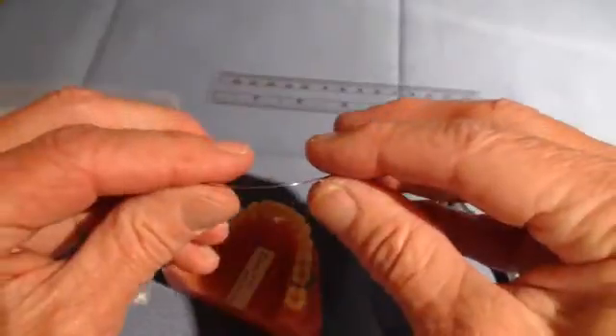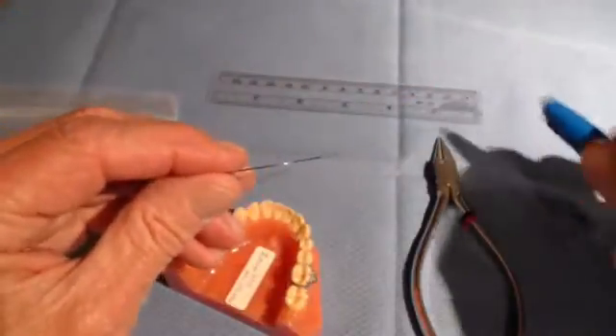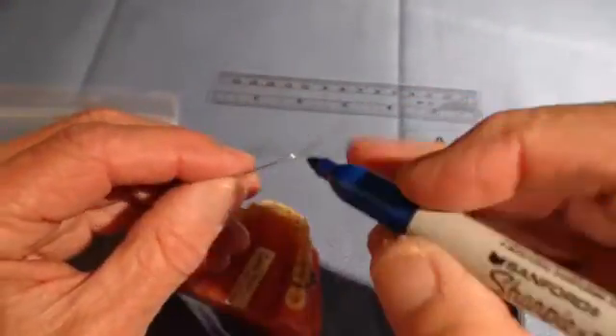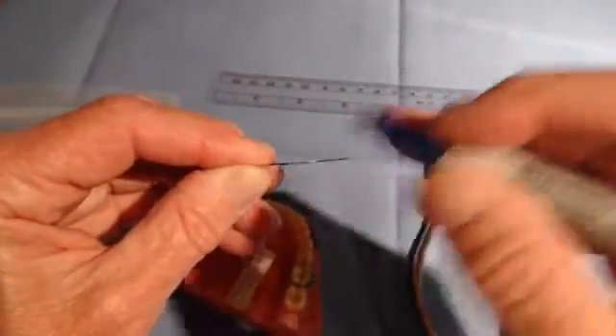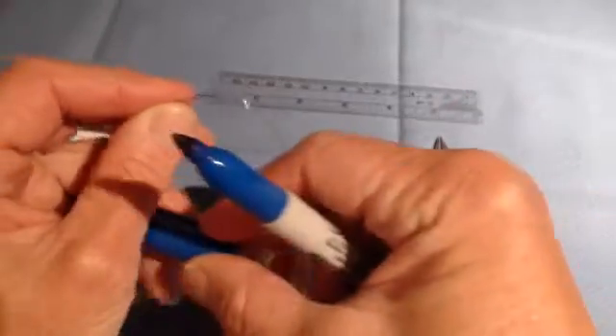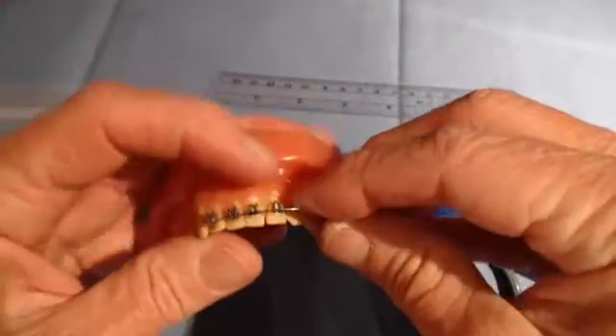The next step: I want to mark the midline with a better pen because it's so difficult to see the midline here. So I will mark it right there. That way, I will be able to put the wire back into the midline for each of the following procedures.